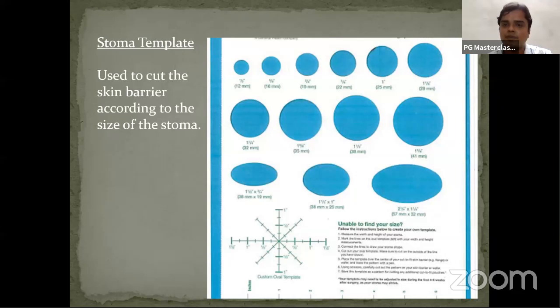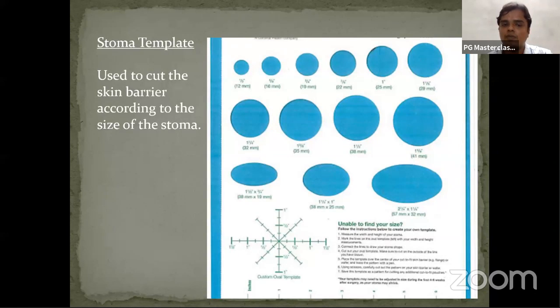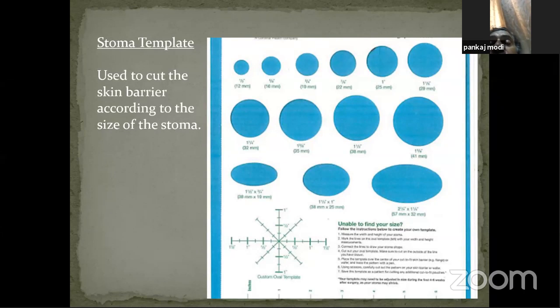And what I want to say is, in which condition are stoma bags usually not applied early? There are two. One is a pediatric patient, a newborn patient, right? A patient having anorectal malformation or Hirschsprung. The pediatric patient usually, because they are more tolerant and chances of other things are less, and they cannot tolerate a stoma bag very easily. So in those patients, it is usually a gauze piece; the bag is not applied.